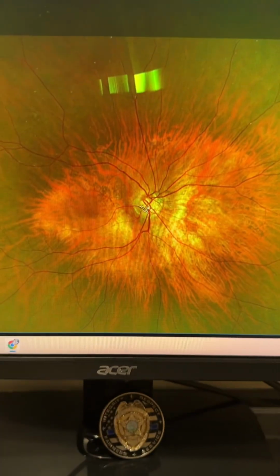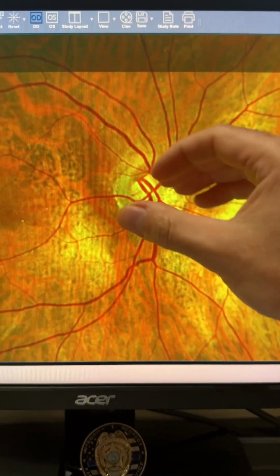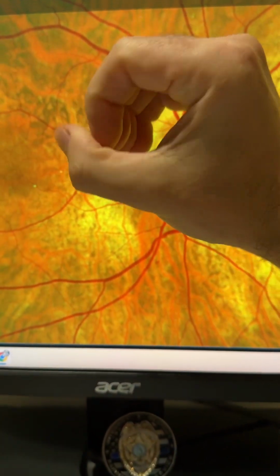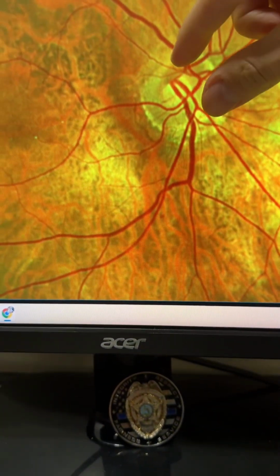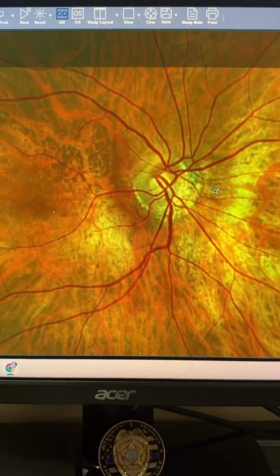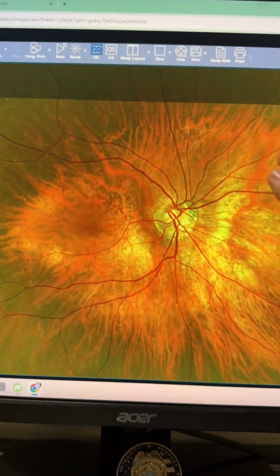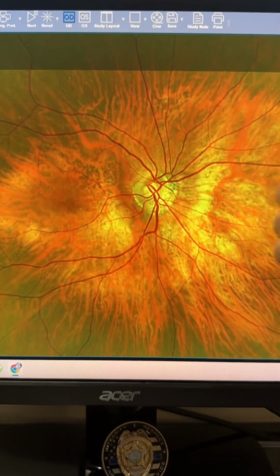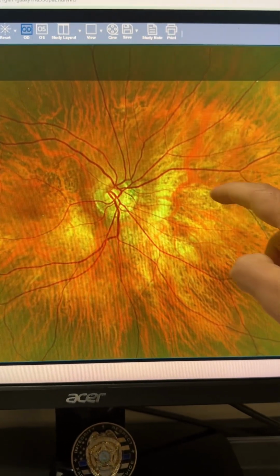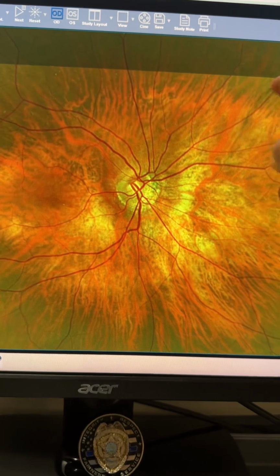Now, what do you see? This eye has a very classic myopic nerve. You see the nerve, instead of being like this, it's like this. You see the orientation is obliquely inserted. That's very classic for myopia. Now, you also have the fact that you can see through the retina because the retina is stretched. So you see the choroidal vessels really well. That's called tigroid fundus because it kind of looks like a tiger.